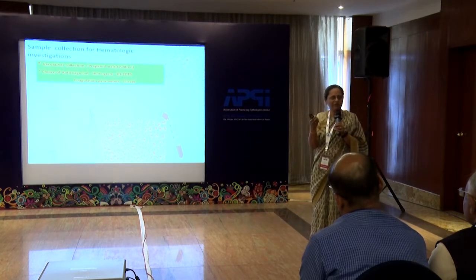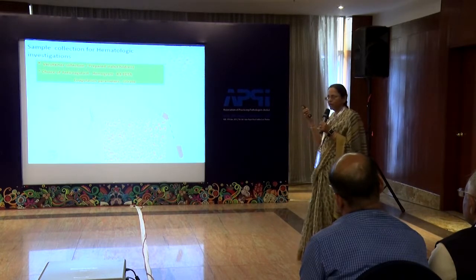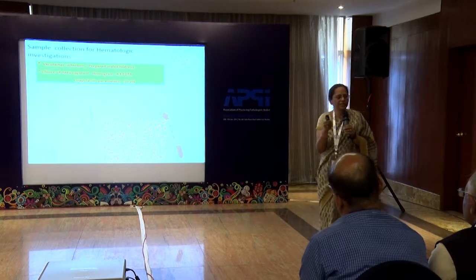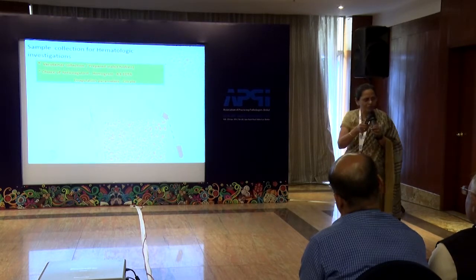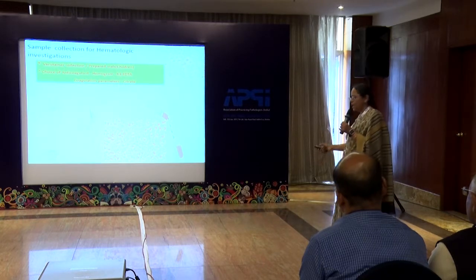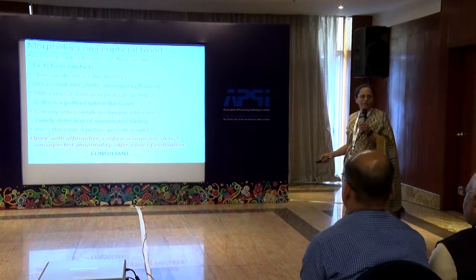We are trained very well to be morphologists. We should continue to use that ability that we have honed. Along with that, remember that your morphology depends on how well you have taken care of these steps prior to that. So unless your smear is well made, unless it is properly fixed, unless it is properly stained, unless it has been collected properly, your diagnostic acumen is all not true.